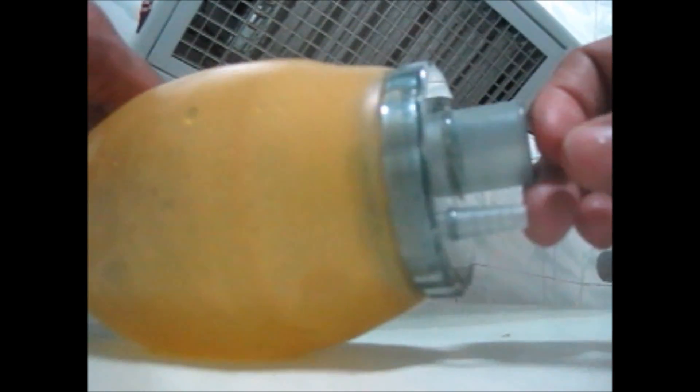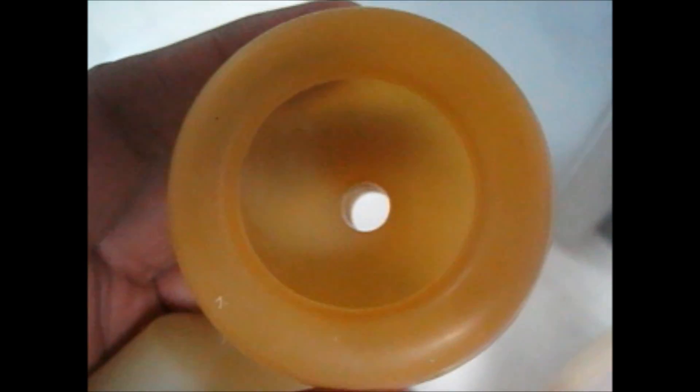Today I'm going to tell you something about the Ambu bag. You can see this is the Ambu bag — this is the inlet and this is the outlet, where we attach the mouthpiece. You can see two kinds of valves inside. Here you can see a valve with a fish-mouth like appearance, and when we compress over here it opens with a slit-like opening.